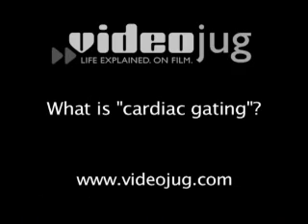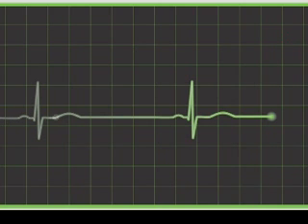What is cardiac gating? Cardiac gating is when we connect the patient, we use ECG, electrocardiogram, to synchronize the imaging acquisition from the camera system when we are doing cardiac imaging tests. The reason for that is that we can actually look at the function of the heart, the beating of the heart during imaging acquisition.